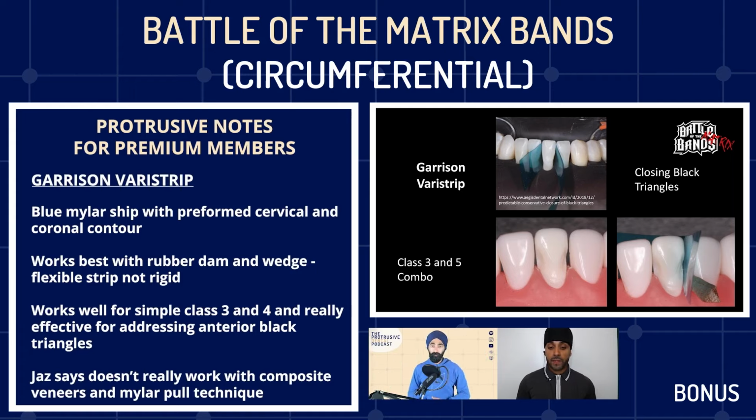No, that makes a lot of sense to me. Actually, I've got a really unpopular opinion here. I'm not a fan of the mylar pull technique at all. So I don't do that at all. So that's cool. Well, how do you do it? How do you manage your composite veneers adjacent? When we pull out the trump card, I will be revealing all.